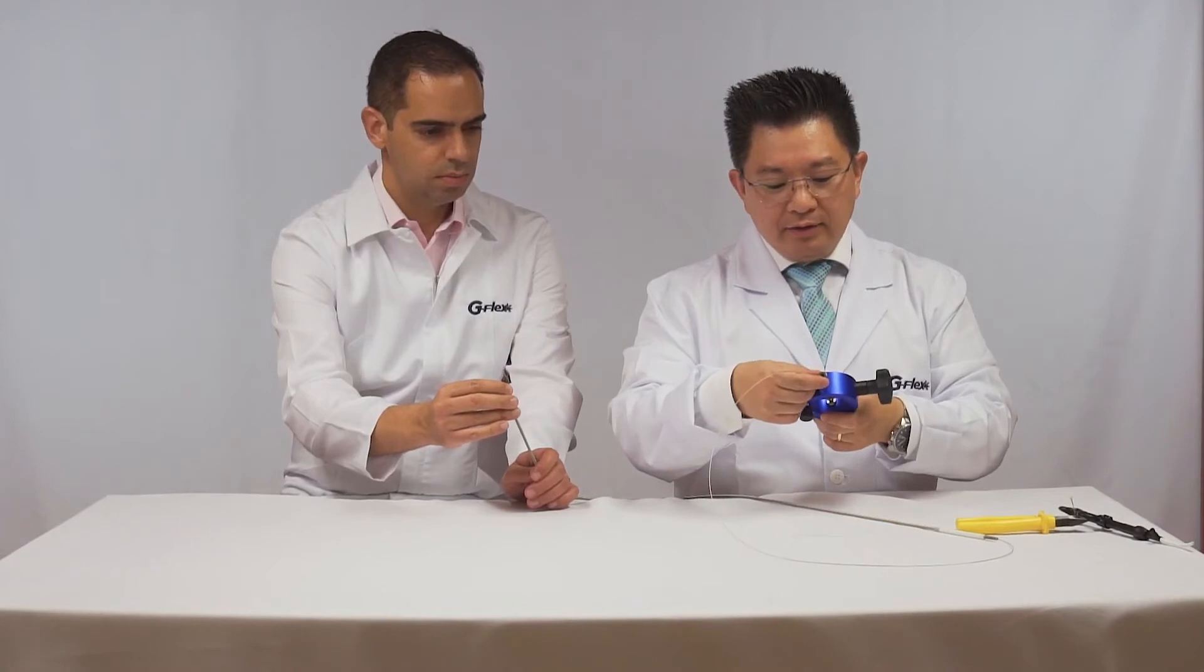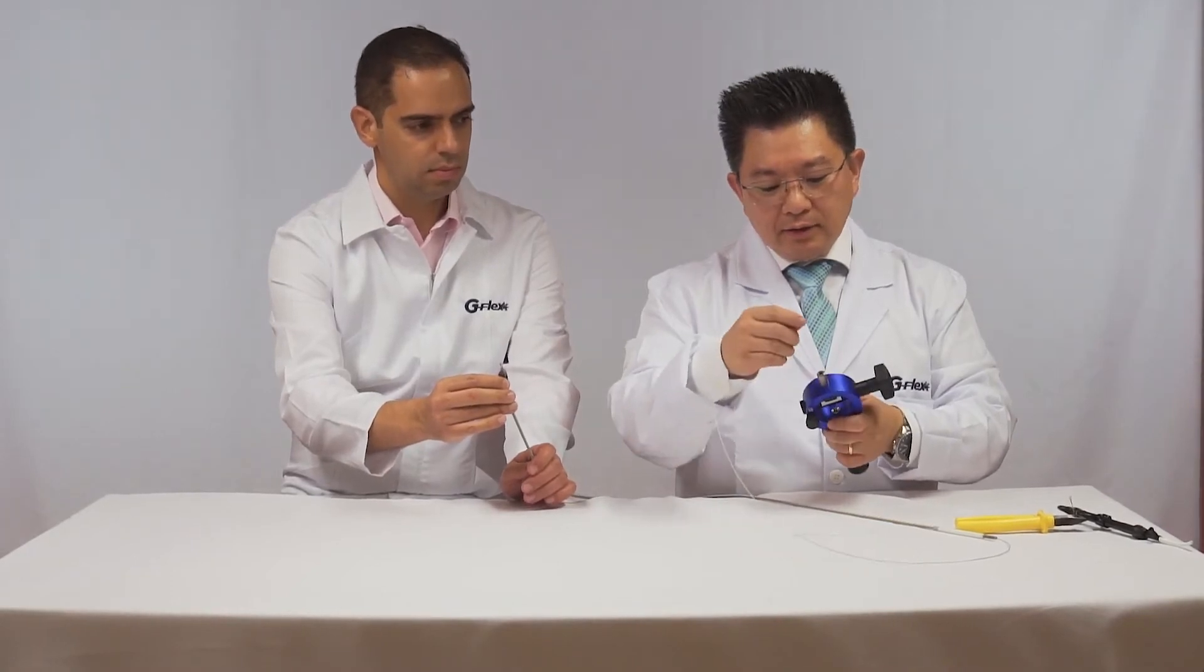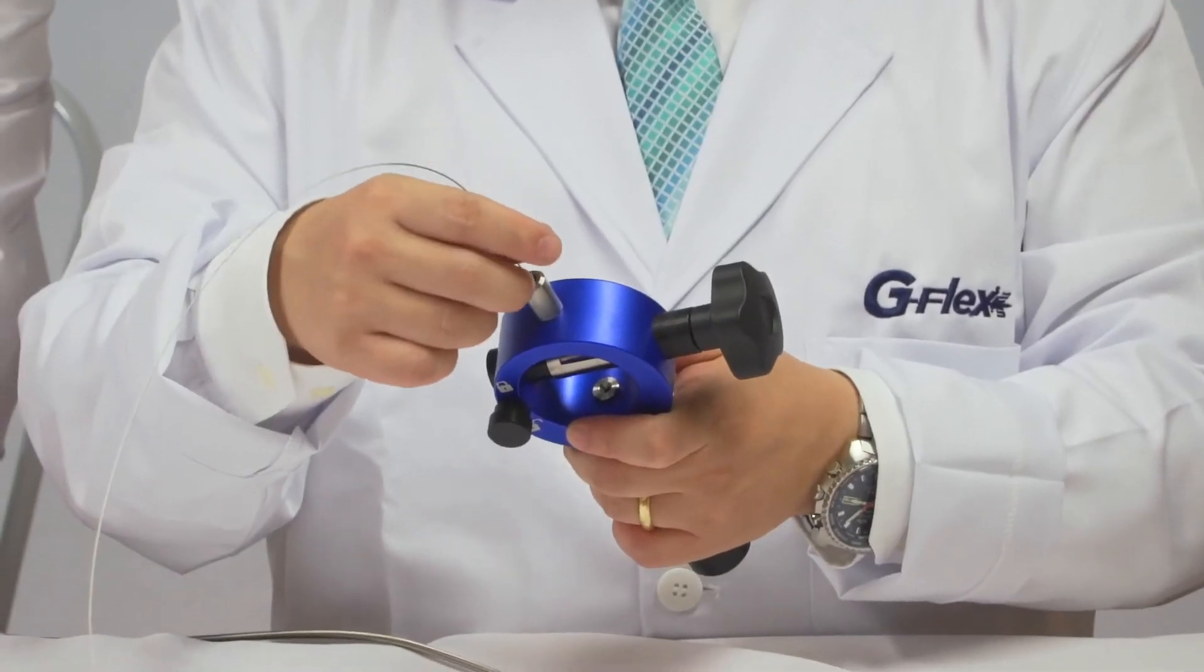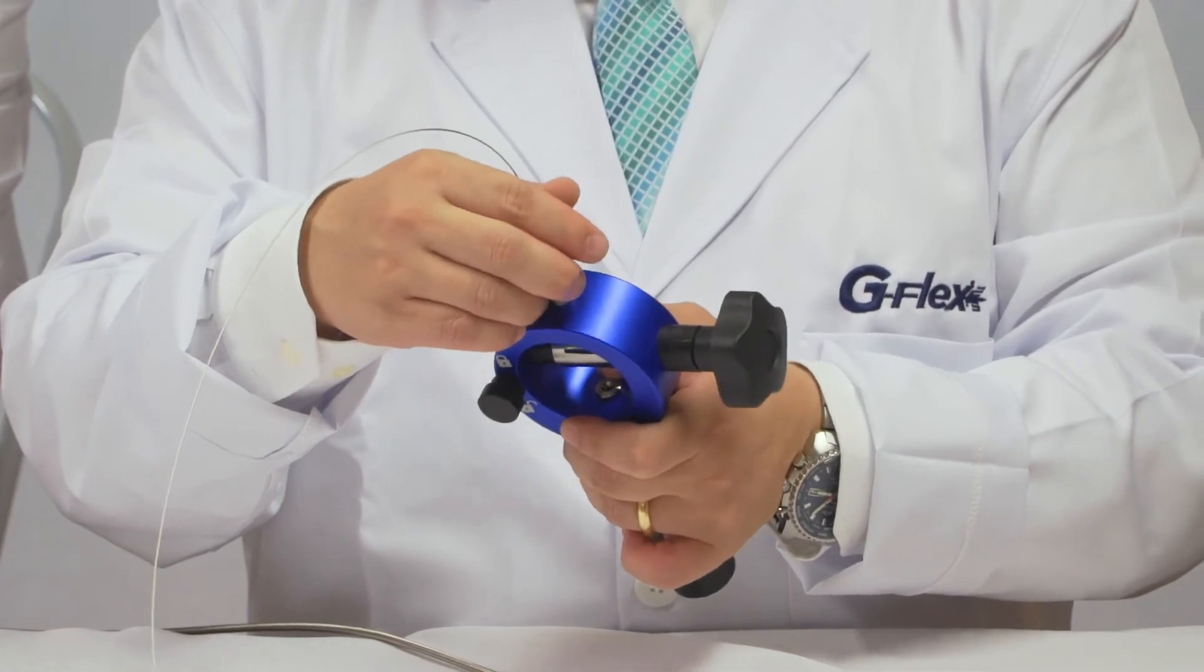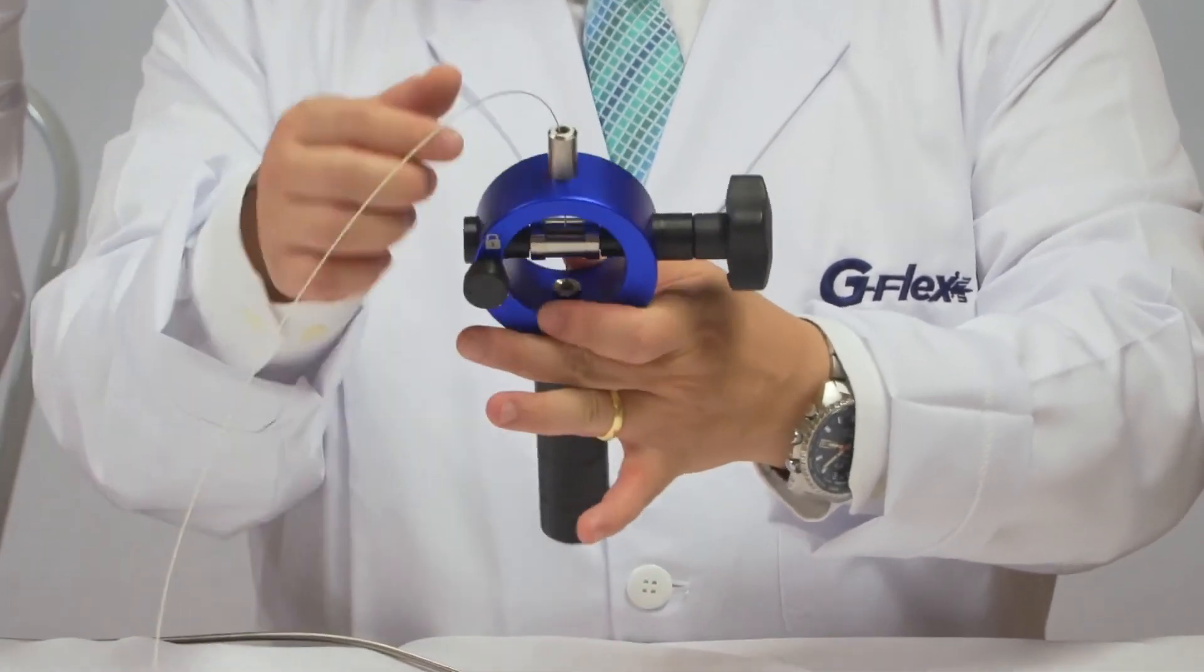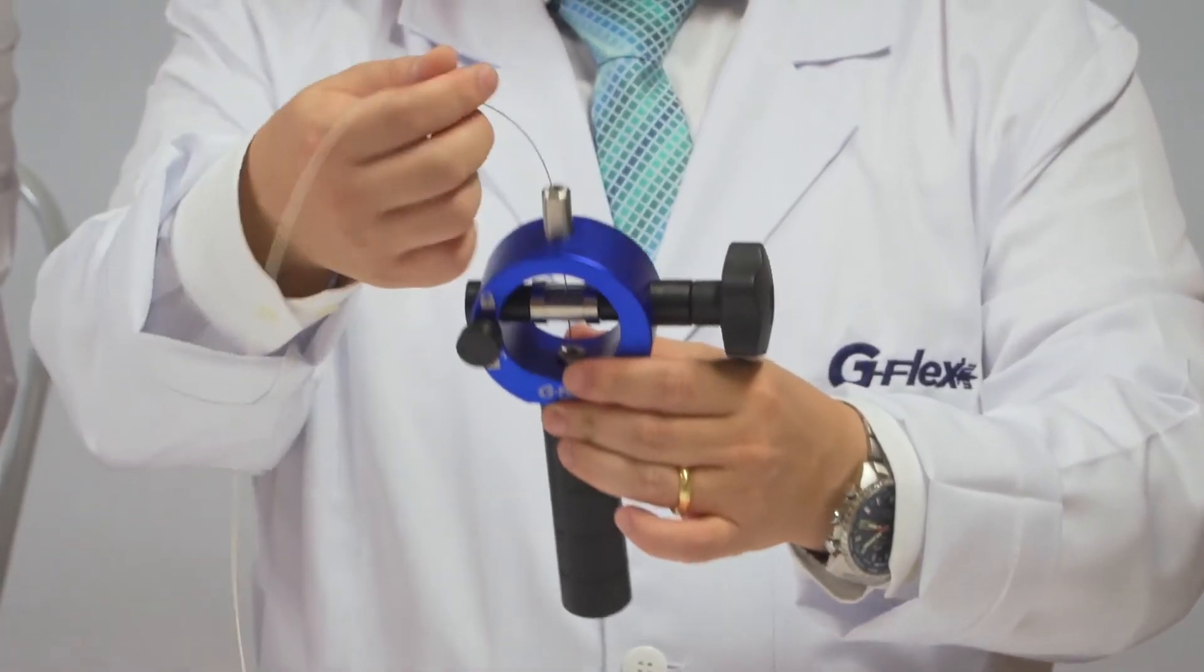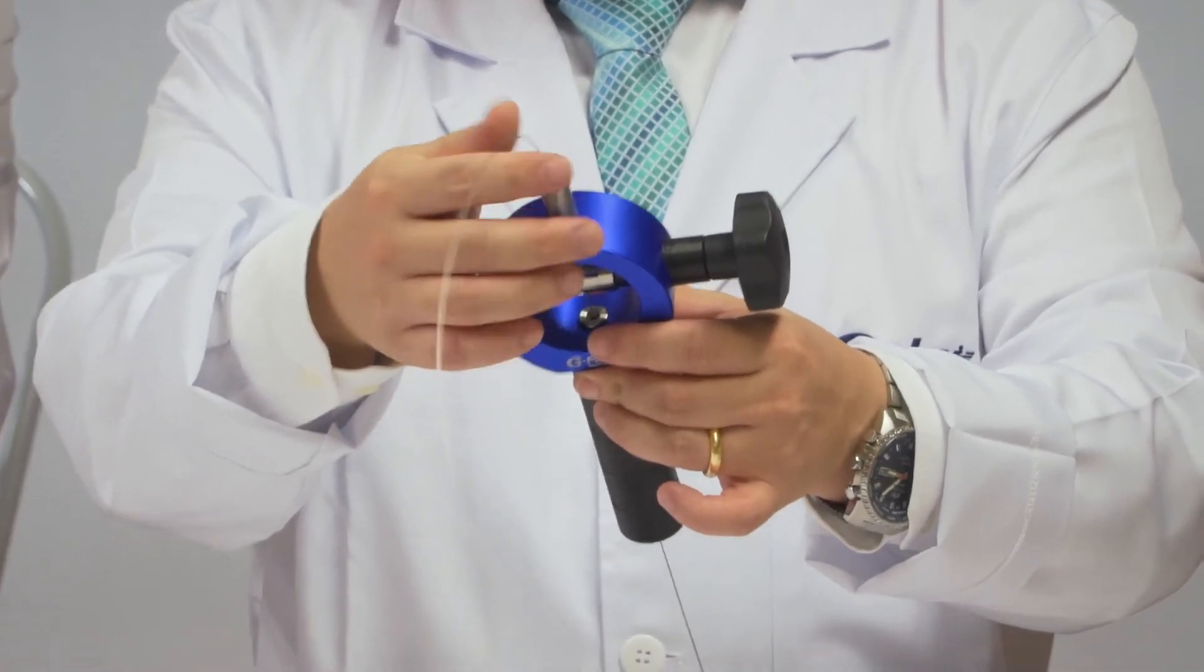As you can see, you have on top a wall where you can insert the wire that passes through the handle, like this.